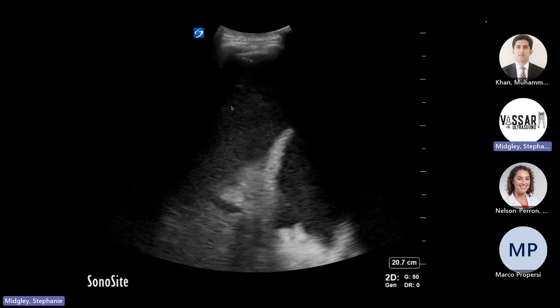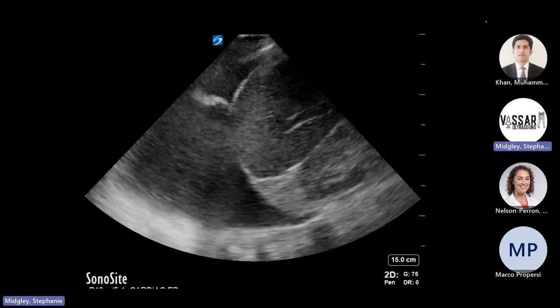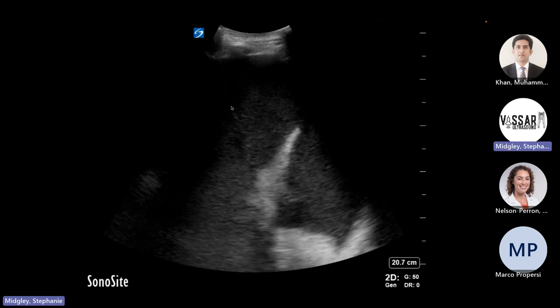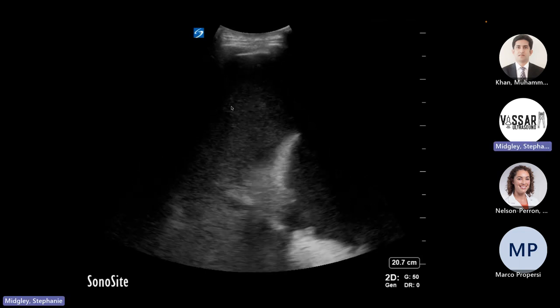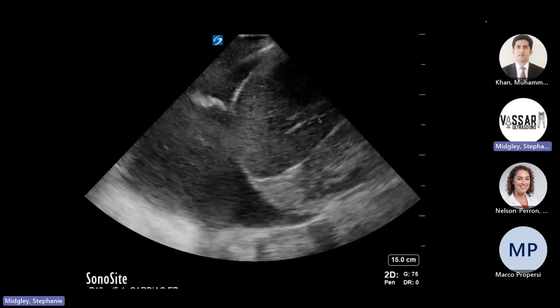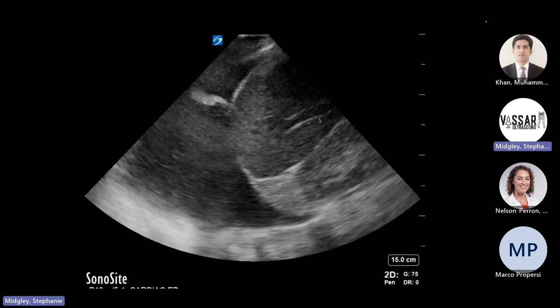This is a little hard to tell. This is the same view of this patient, just kind of zoomed in. So this is where not enough depth makes it hard to figure out what it is you're looking at. I feel like I'm looking at Dumbo waving his trunk at me, right? But once I zoom out, I'm like, I totally understand, right?